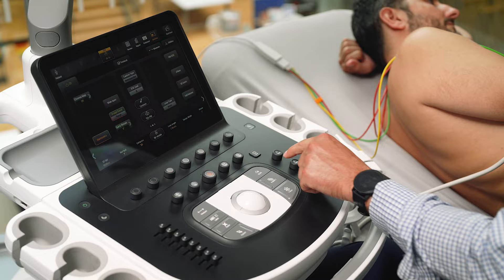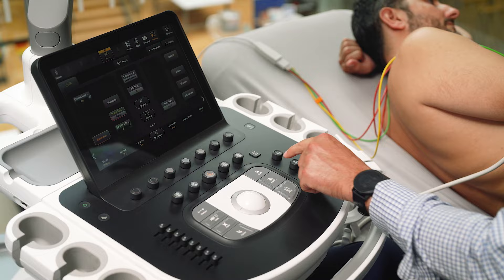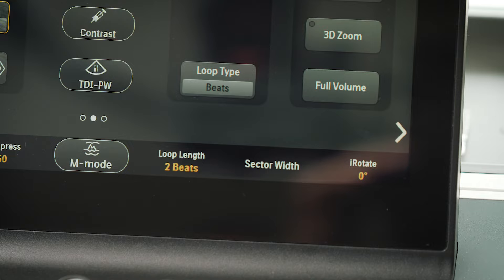As a standard practice, I'll begin by reducing the depth, moving the focus and sector width as appropriate for my structure of interest.